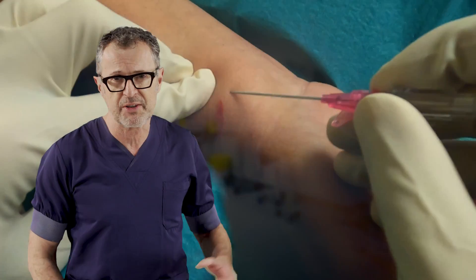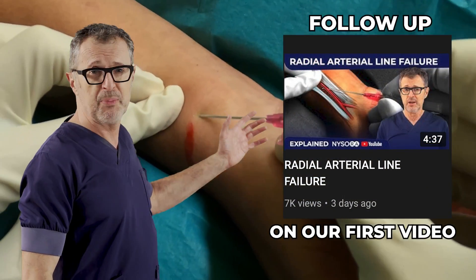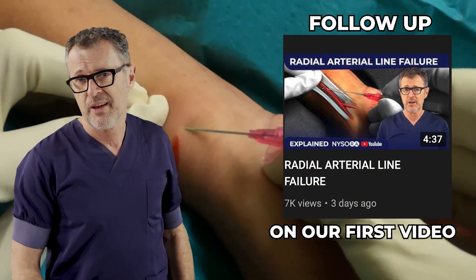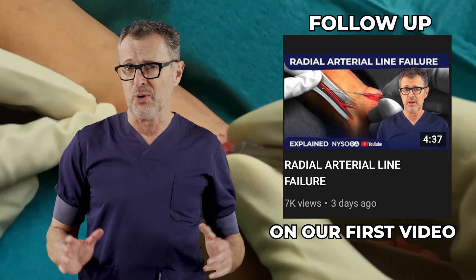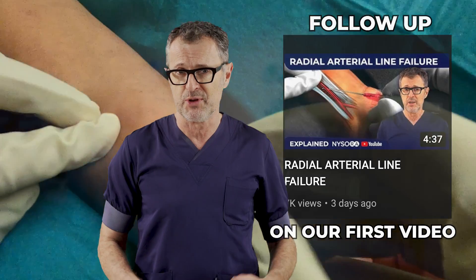As promised, we are back with a video demonstrating the solution on how to troubleshoot a difficult radial arterial line placement after repeated failure. Thank you to all of you who have invested your time to watch the last video and shared your tips and tricks on how to troubleshoot this clinical challenge.